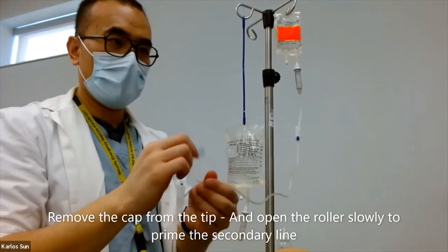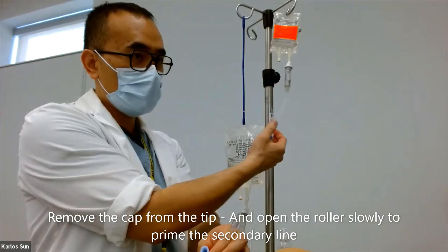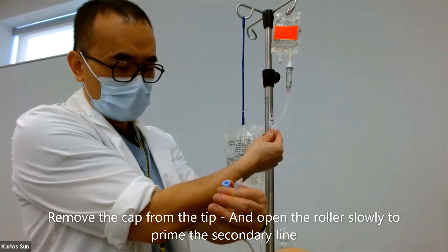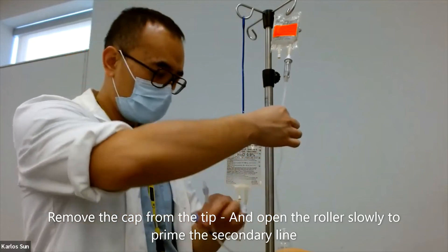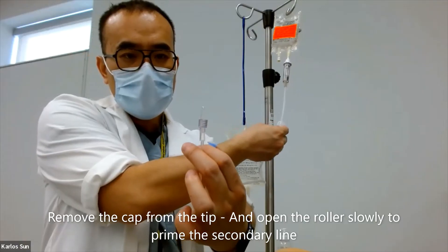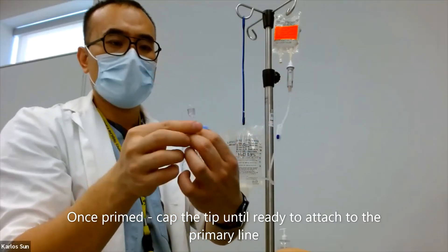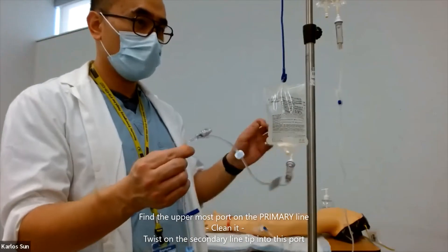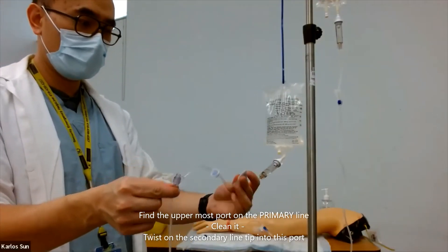Remove the cap from the tip and open the roller slowly to prime the secondary line. Once primed, cap the tip until ready to attach to the primary line. Now find the uppermost port on the primary line. Clean it and then twist the secondary line tip onto this port.